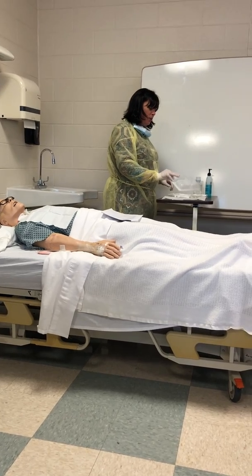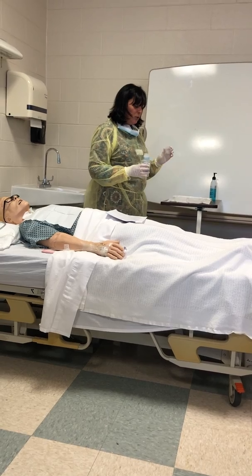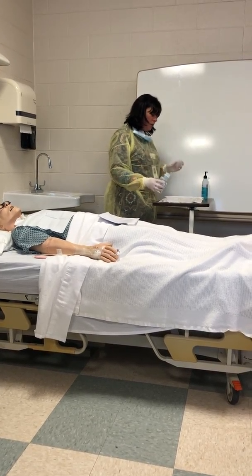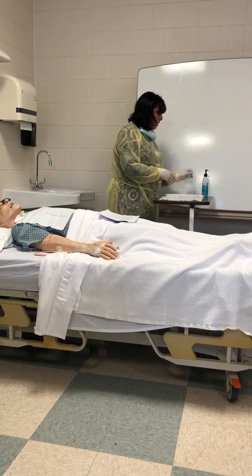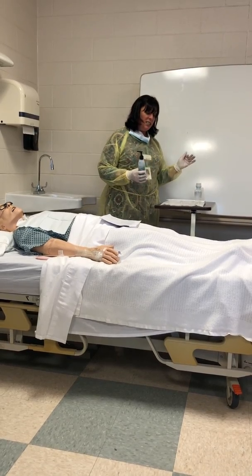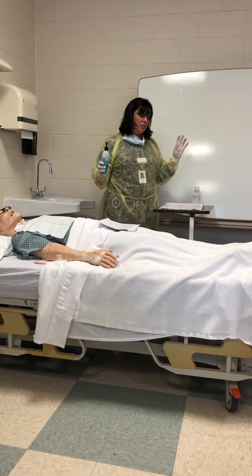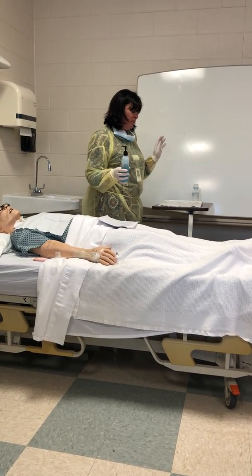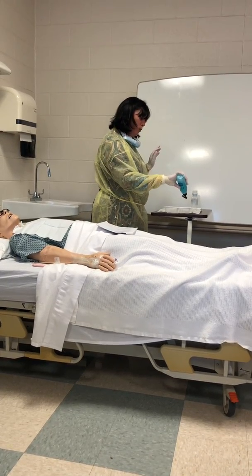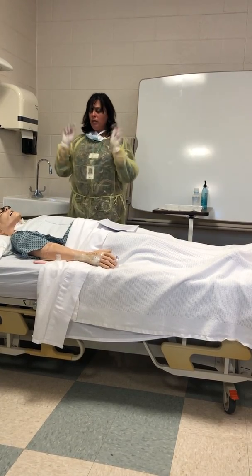If you have a sterile field, and I do, right there, you can dump your stuff out on it, or you can leave your stuff inside of there, whatever you prefer to do. You can take your sterile saline or sterile water, whatever your facility states, and pour that inside of there. And then I always did peroxide. Not for sure. Sometimes they say mix peroxide with sterile water. Sometimes they don't say peroxide. I feel like I went rogue as a nurse a lot. So, I always did peroxide, filled it up. I have on clean gloves.